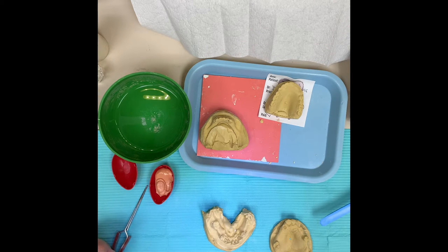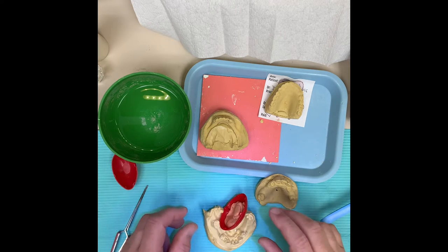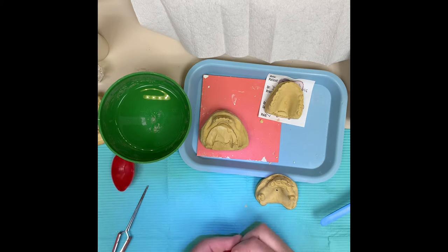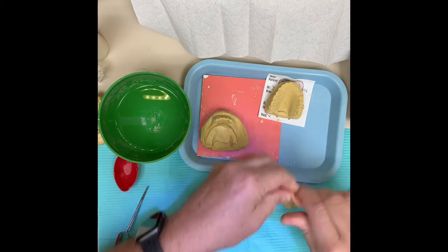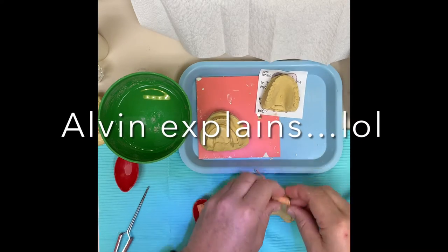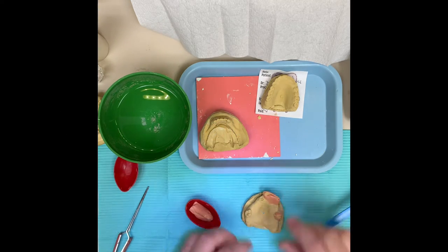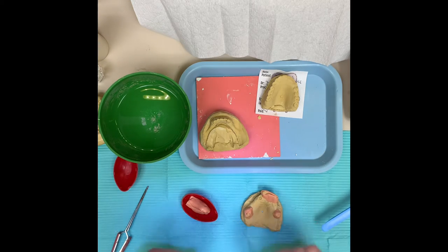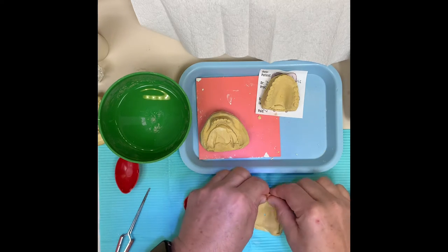If you've ever used compound, you know what a pain it is - it's something they taught us in dental school that everybody learns to hate. So the first thing is you want to block out the teeth. Take the silly putty, pinch some off, and wrap it around the teeth like this. You don't have to get too fancy with it. The reason you use silly putty is because it doesn't lose its shape if it's heated up, as opposed to wax, plus it's reusable and inexpensive.